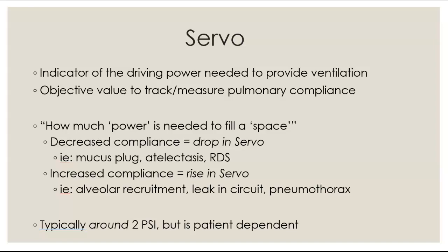I like to think of it as how much power do I need to fill up a certain space. So if we have decreased compliance, say all of a sudden the space we need to fill shrinks, all of a sudden our servo pressure will drop. A mucus plug, severe atelectasis, respiratory distress syndrome.